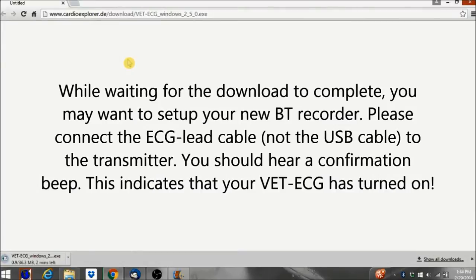While waiting for the download to complete, you may want to set up your new BT Recorder. Please connect the ECG lead cable, not the USB cable, to the transmitter. You should hear a confirmation beep. This indicates that your VET ECG has turned on.